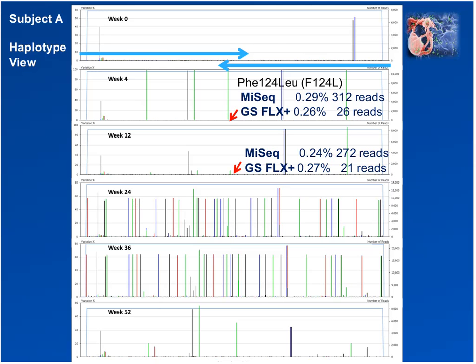It also has now 60% of the virus with all these other variants compared to the virus present at week 0, as well as almost 80% of the virus containing some of these other variants. So it's a complete mixture of viral strains. And so the actual proportion of wild type, which has no variants in it at all, is probably very low.